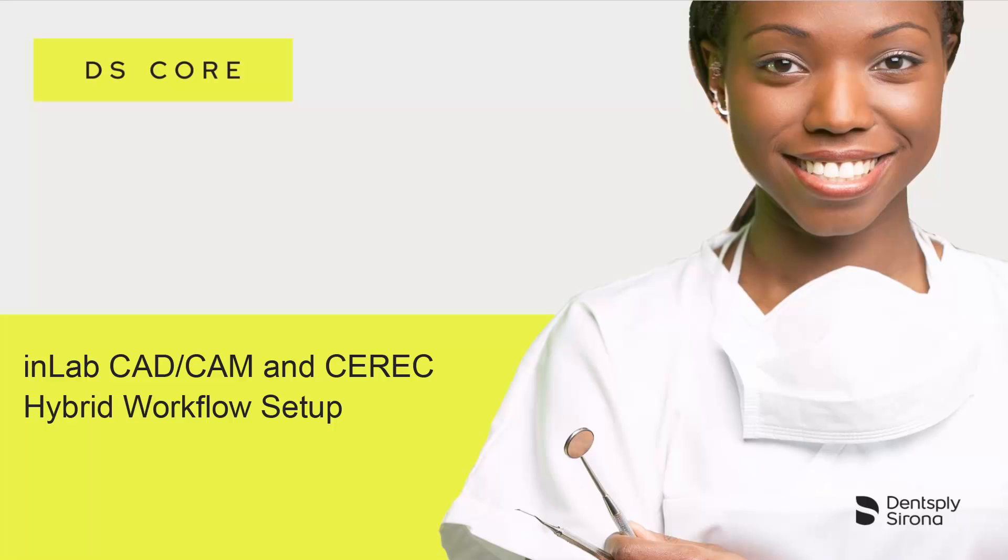Welcome to this video tutorial on the topic of DSCore. In this video, we will guide you through the InLab CAD-CAM and CEREC Hybrid workflow setup.